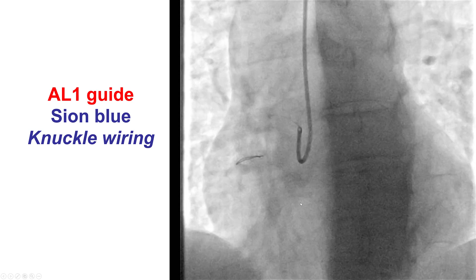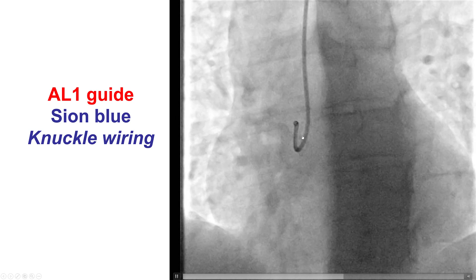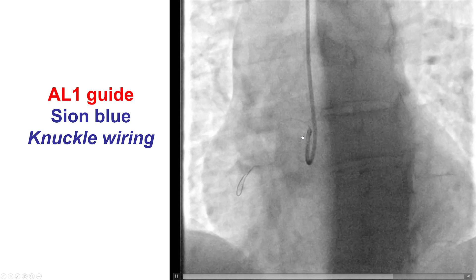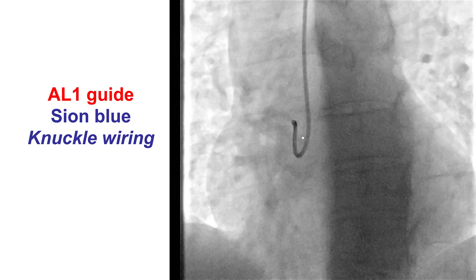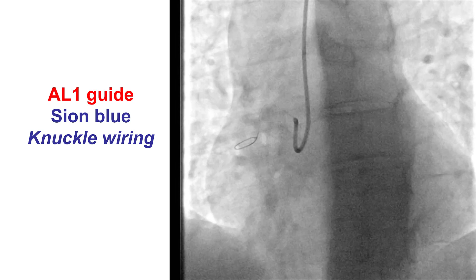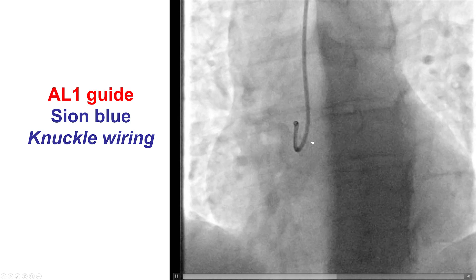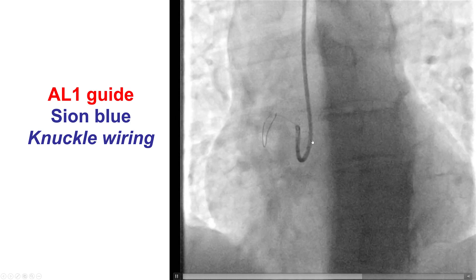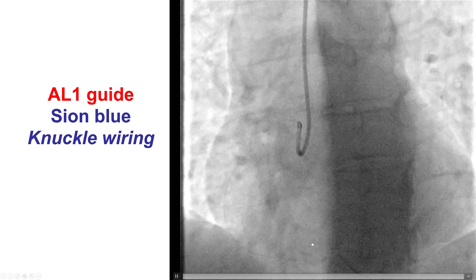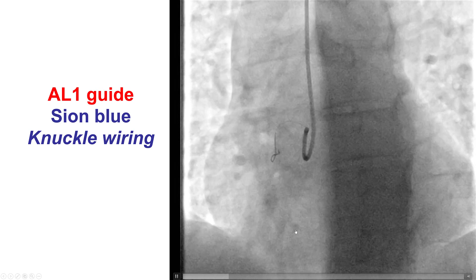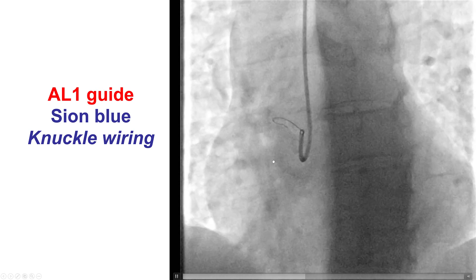And this is the wiring. We used an Amplatz 1 guide catheter, which is our standard guide for performing PCI of the right coronary through radial access. In vessels like these that are very tortuous, sometimes it may be safer and easier to wire by creating a knuckle and advancing the knuckle through the area of thrombus. This was a workhorse Sion Blue guide wire.